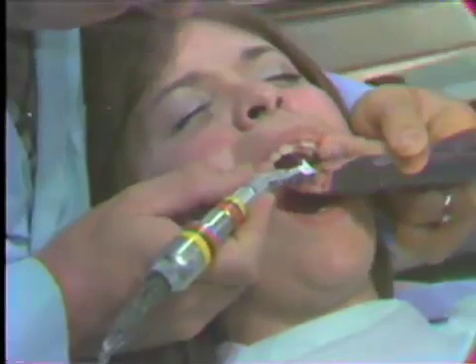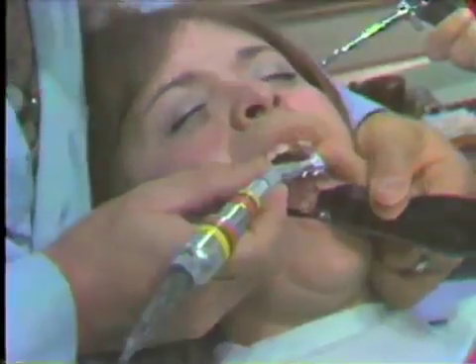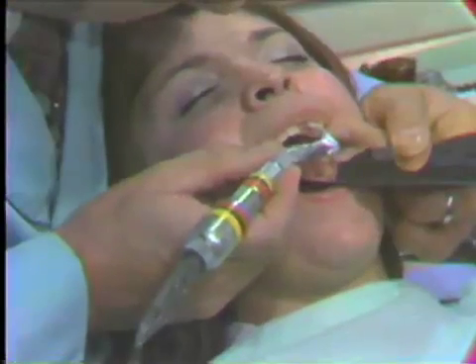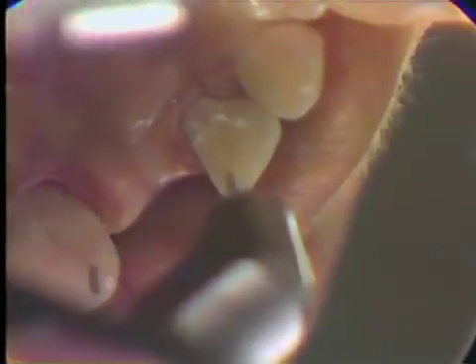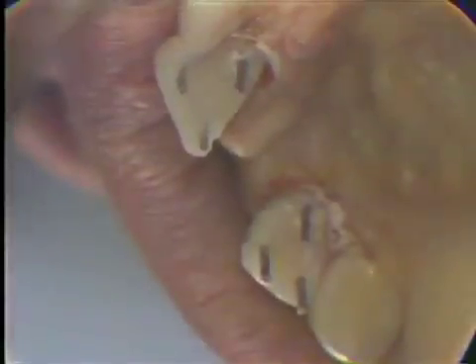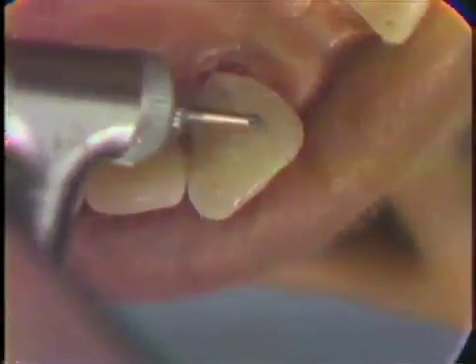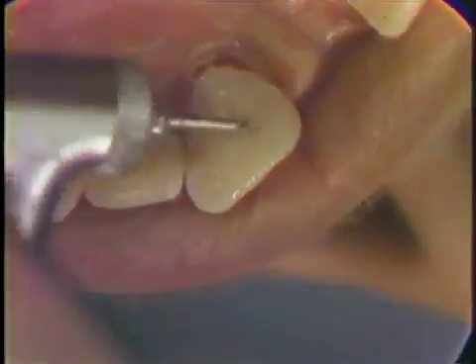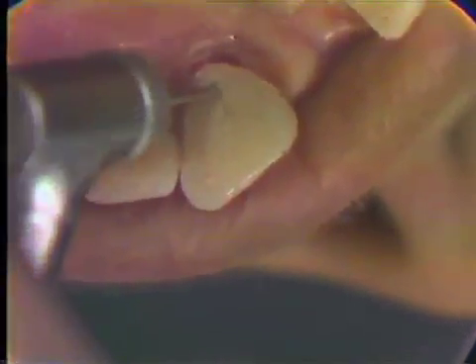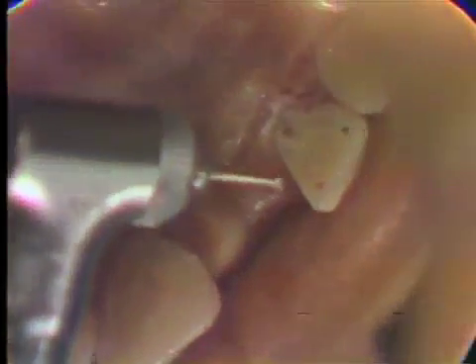Now we'll check this from two different directions — line it up and see how it looks on the lingual, then look from the distal at right angles. You can use your assistant for this or just turn your mirror. We'll drill that, but again only to a depth of about a millimeter to see if we're on the right track. You can see that they all line up. Next, we bevel the opening of the pinhole into the tooth using a number four round bur to establish this bevel. This will make it easier for the pin to slide into the tooth — creating a funnel at the opening of the pinholes.